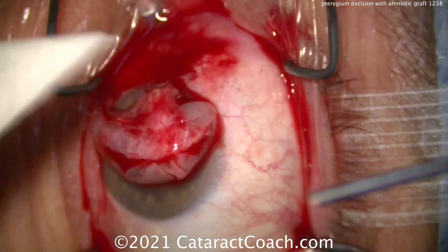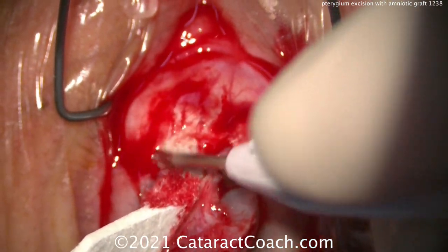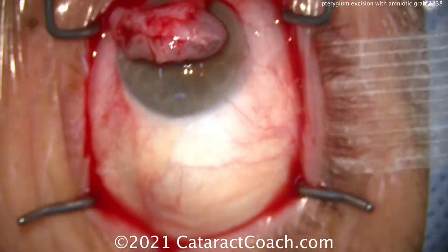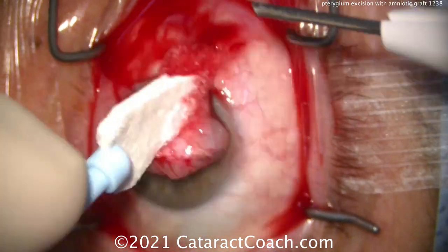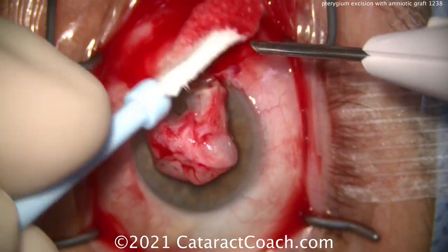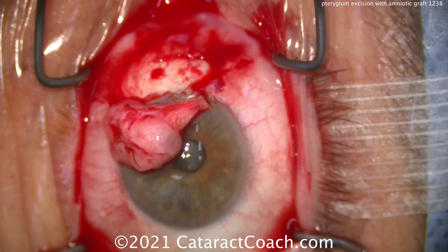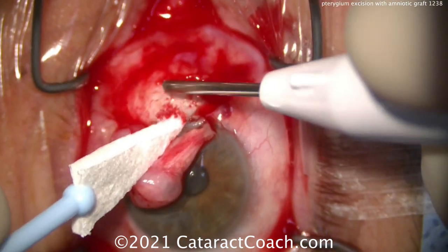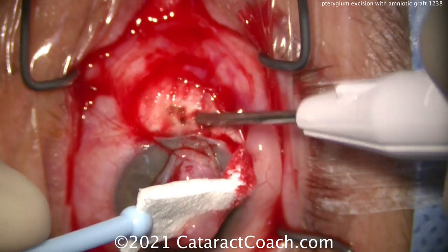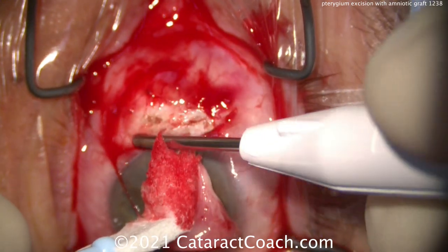Now we'll do a little bit of cautery. We're just leaving the pterygium on the cornea for now, and we can dry this off and do some cautery. I want to stop the bleeding, but we don't want the sclera to be totally avascular — so there's a delicate balance here. We sped up the video here because I want to show you the whole case, but take your time with the cautery. You want just the bare minimum amount of cautery needed — don't go overboard. You need a little bit of blood in order for this to heal. If you keep the sclera totally avascular and white, this patient may not heal as well as you want.